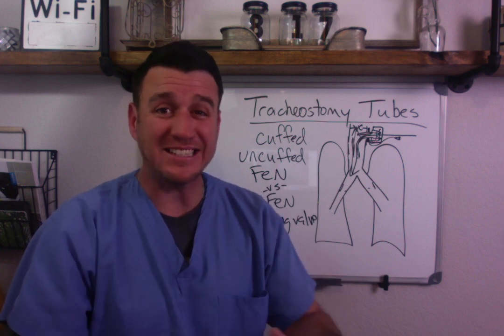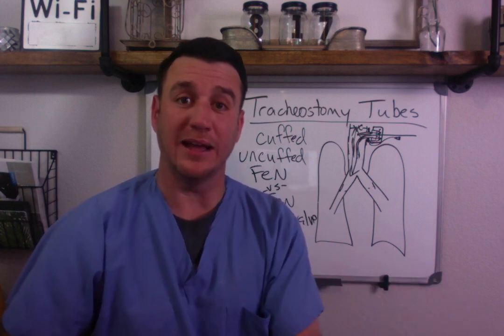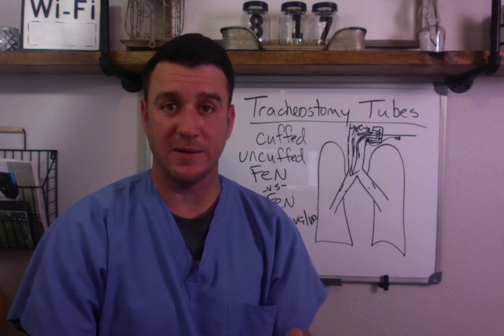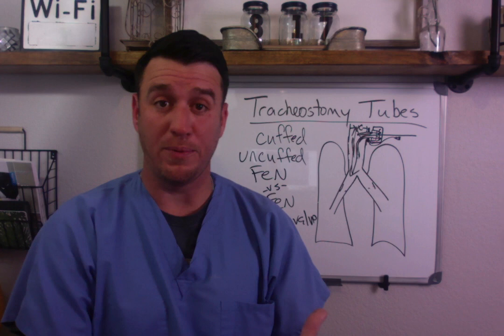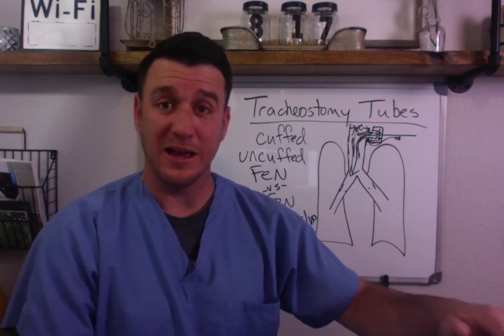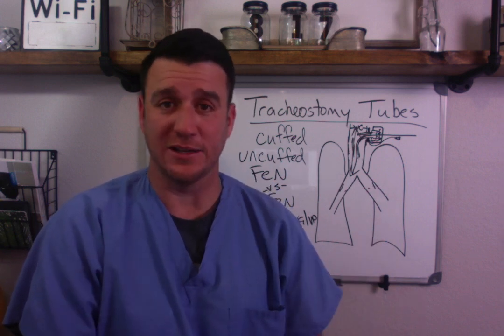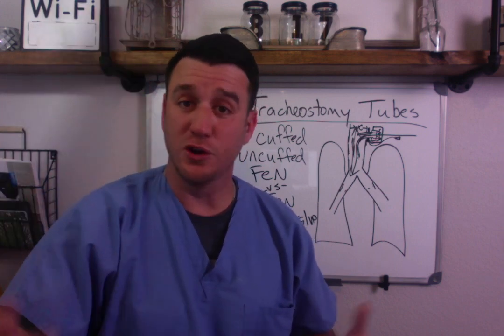That's the scenario if you need mechanical ventilation at night and a speaking valve during the day. You've got to have a cuffed trach. A fenestrated trach, while it's not necessary, would help. But you have to understand that if you use a fenestrated trach during the day to aid speaking, when you flip to mechanical ventilation, you have to insert a non-fenestrated inner cannula, or air will just leak out past your upper airway during mechanical ventilation.